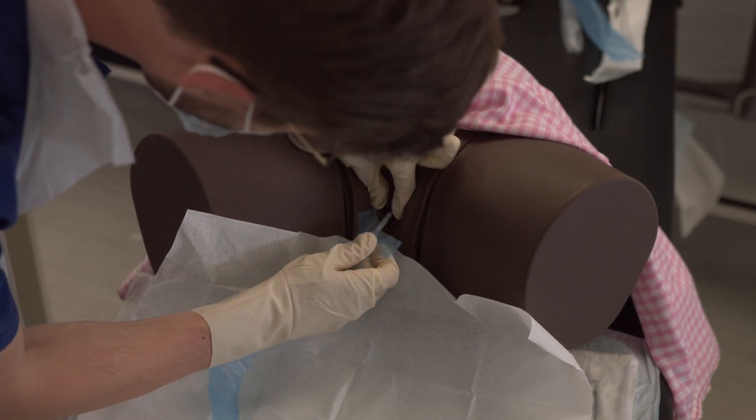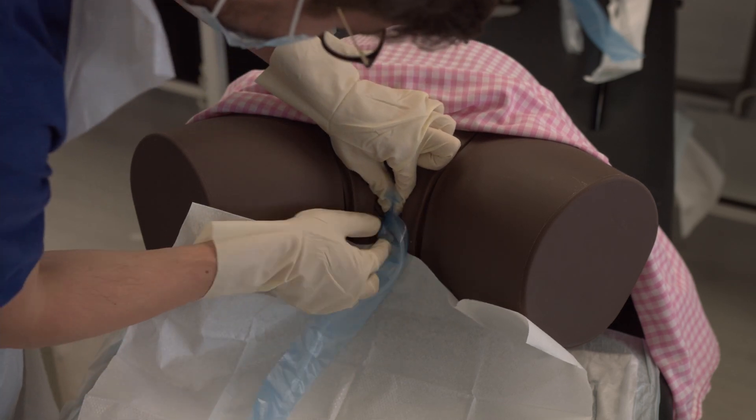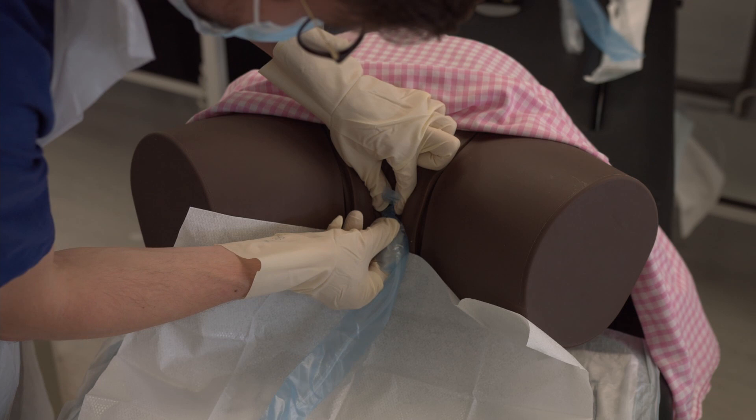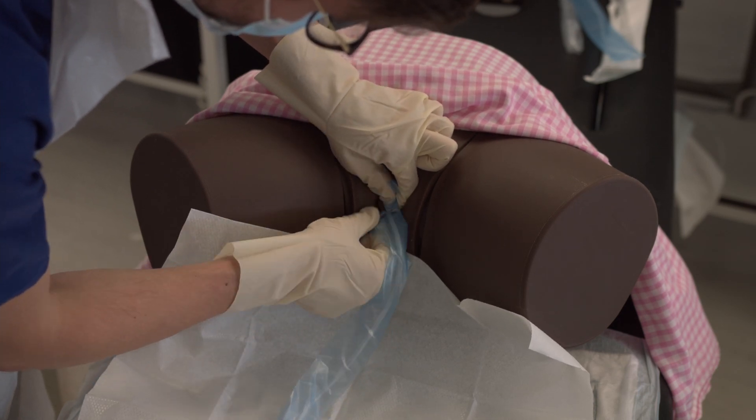Part the labia with your left hand and then insert the tip of the catheter with your right hand. As you insert, the perforated bag should be protecting the catheter from contamination. Rip open the bag with both hands as you insert.